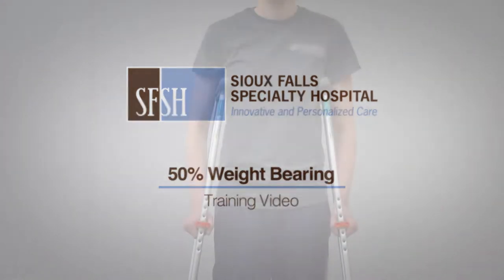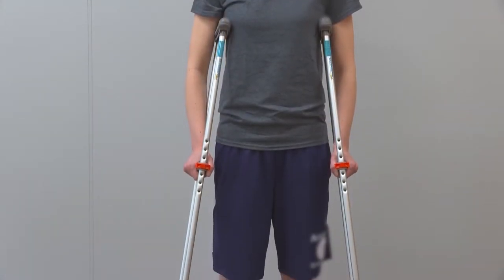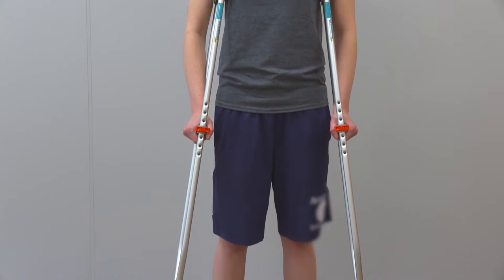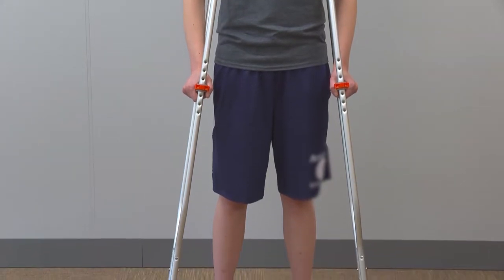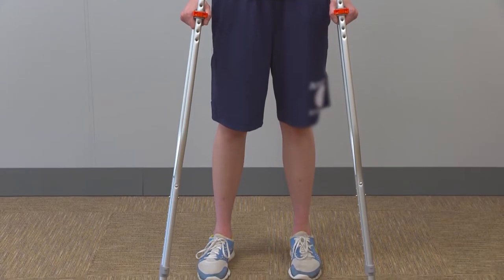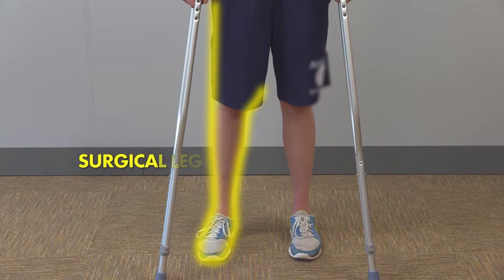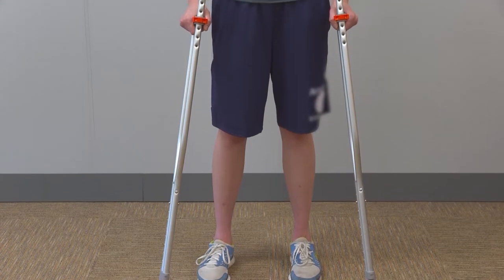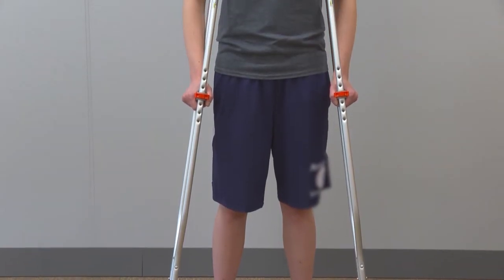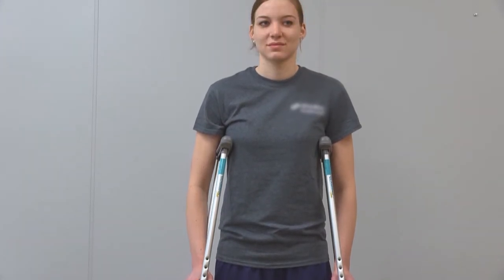50% of your body weight is when standing in a normal posture with equal weight through both legs. You can stand at the sink or in the shower without using an assistive device as long as you are pain-free with equal weight through both legs. Try not to shift your weight to the non-surgical side. If pain is present when attempting 50% weight-bearing, then use the crutches to take the weight off the surgical leg. When taking a step with your non-surgical leg, your arms must take 50% of the weight through the crutches to maintain this weight-bearing status.